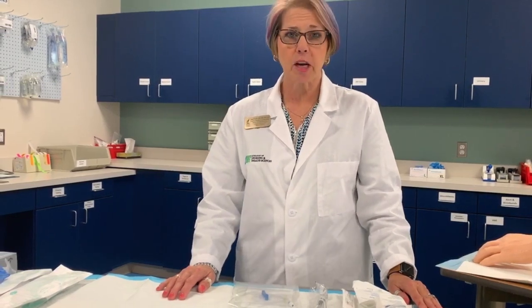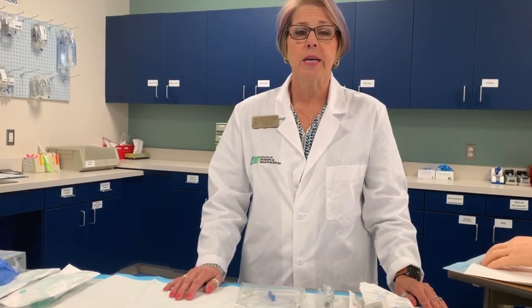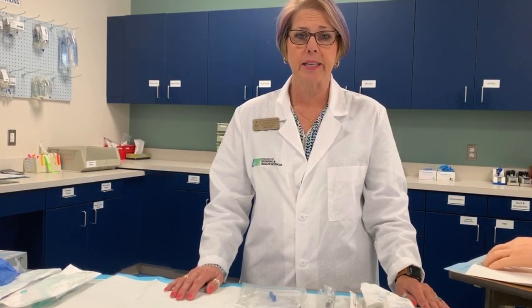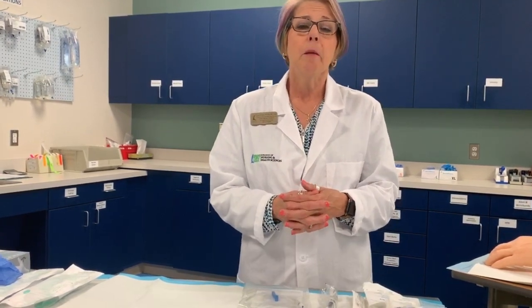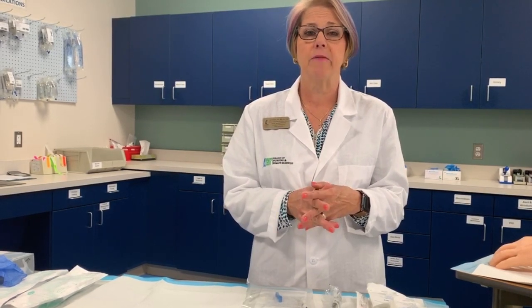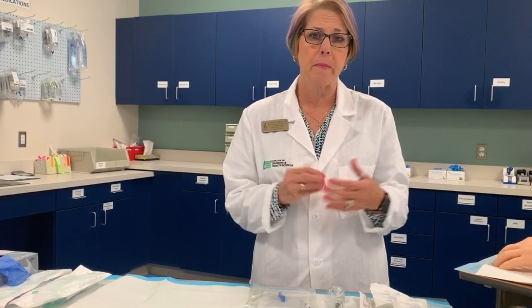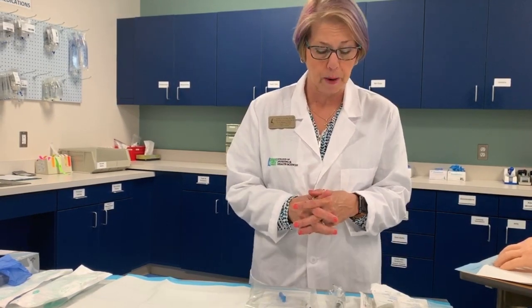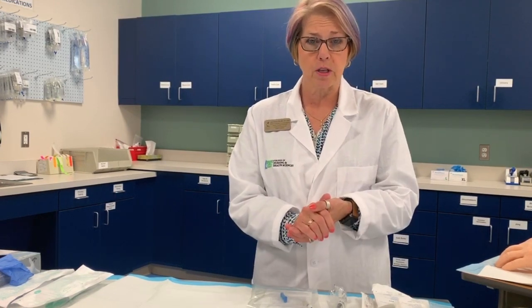Hi, today we're going to talk about starting an IV. So before we get started, you want to make sure that you review your healthcare provider's orders to make sure you know what kind of fluid needs to be run if we're going to start fluids, and what we're using the IV for. Remember that our patients' IVs are our lifeline for them. It is how we give nutrition, medication, fluids, and so it's really important to master this skill as you move along. After we've looked at our physician's orders, we want to gather our supplies.